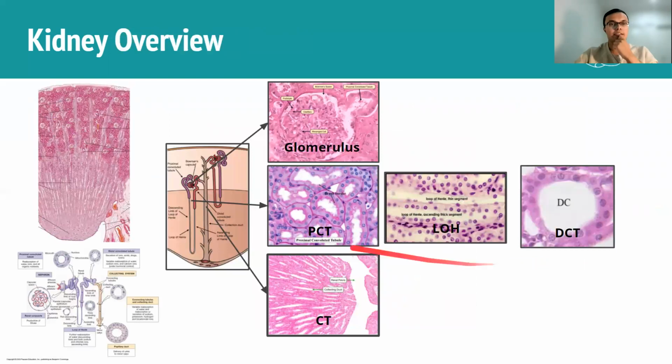All right, and here's a bit of an overview of everything we've covered so far. These diagrams try to put everything into one concise slide. I think what's really useful as an exercise is to look at the image over here and see if you can identify what we've talked about so far.